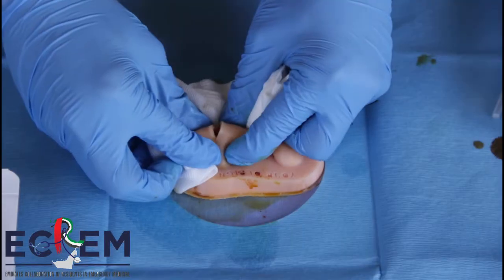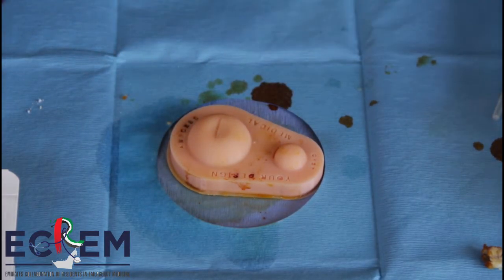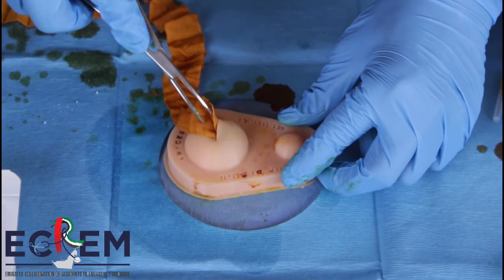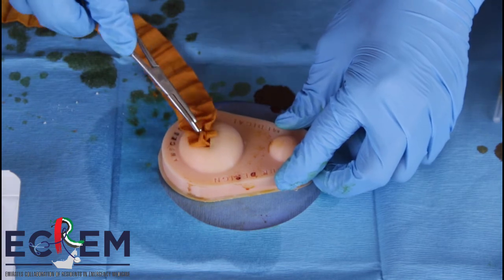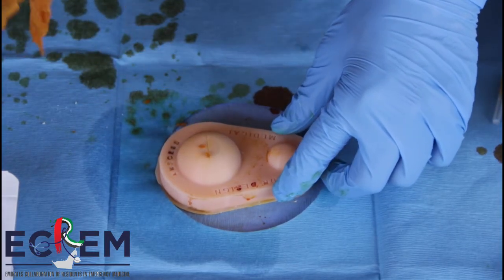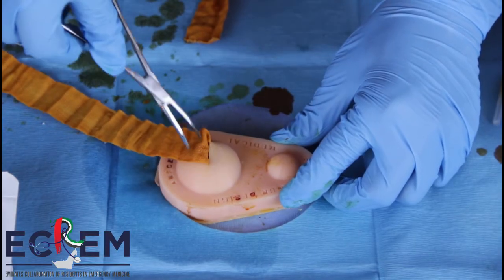I'm just squeezing the remaining pus out. Now it is removed. For packing, you use the iodoform packing strip. I'm going to pack it with iodoform strip — you keep going in and apply it until you feel it is fully covered inside. Now I feel it is fully in, so I remove the strip so that remaining pus gets removed, and then I reapply again, cutting the remaining part.